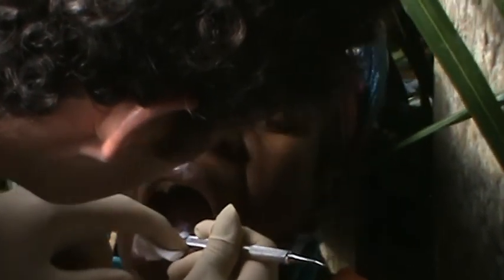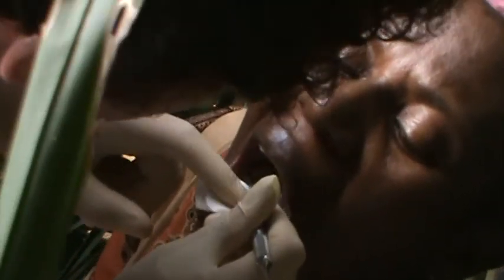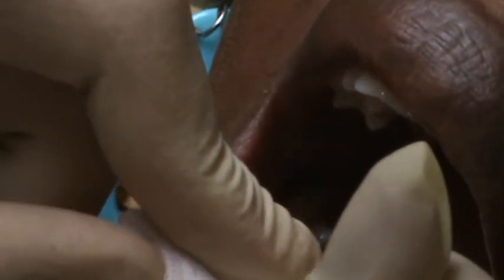You separate the vestibular side. I want to get pretty deep, right? As deep as possible. I need to cut as much as possible so that... listen, see, it hurts.